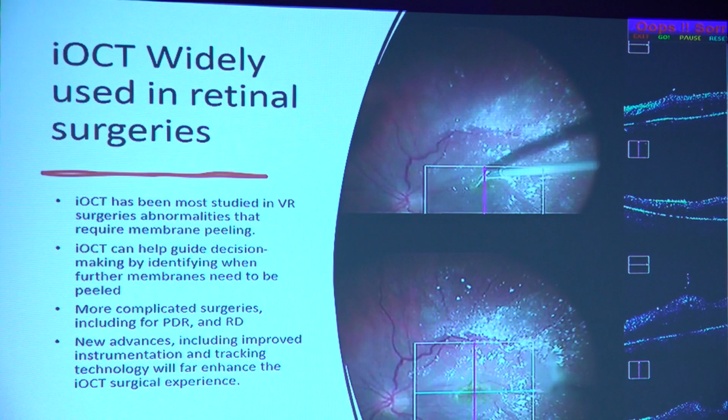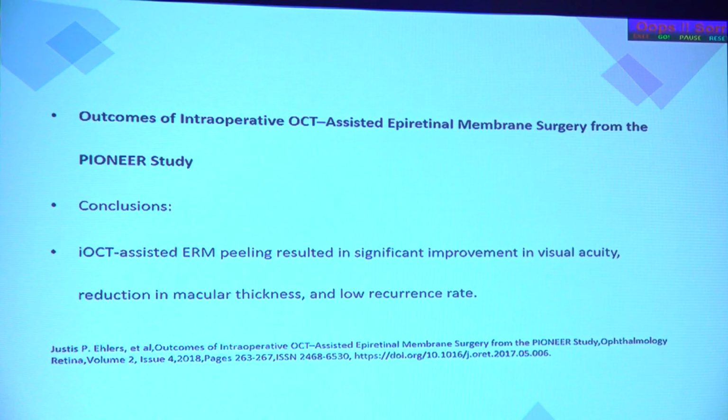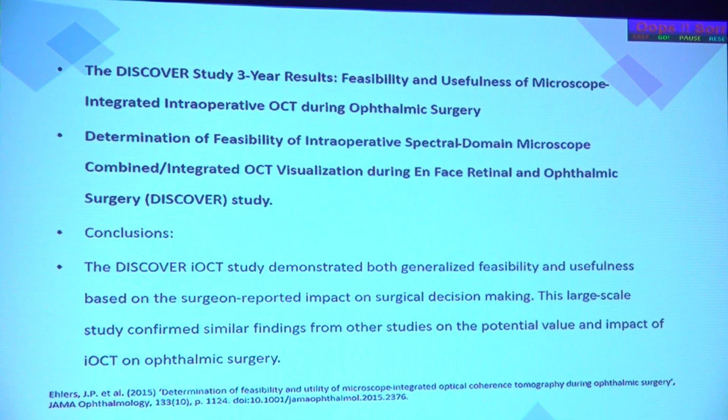Intraoperative OCT has found tremendous use in retinal surgeries. So this is where most of the benefit will be gained by VR surgeons, so that you can help them guide decisions when they're performing surgeries for PDR, RD, or even membrane peeling. This is a pioneer study which says that when surgeons use the intraoperative OCT for the ERM peeling, there was an improvement in visual acuity, reduction in macular thickness, and lower recurrence rate because they're able to do it much more meticulously at better accuracy.